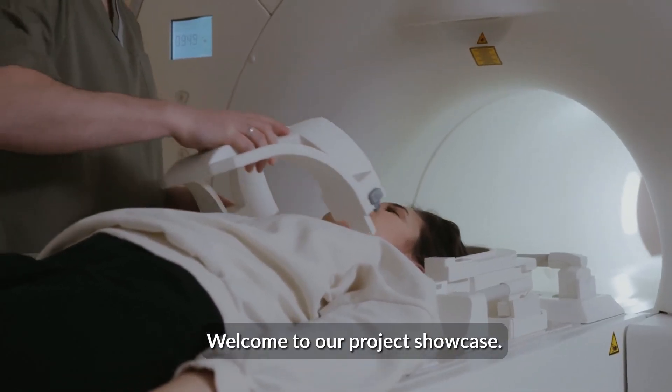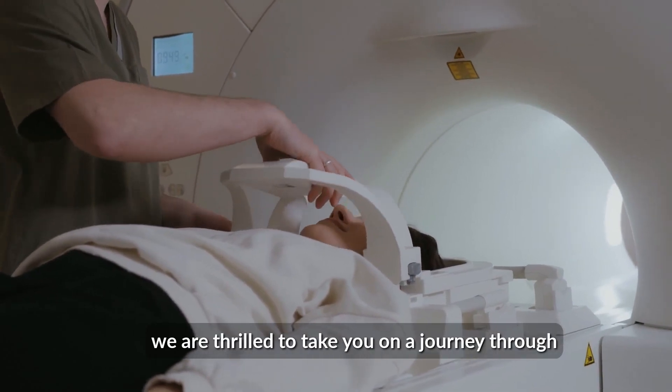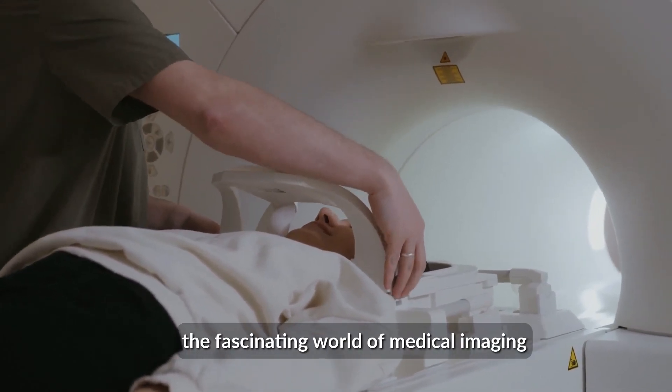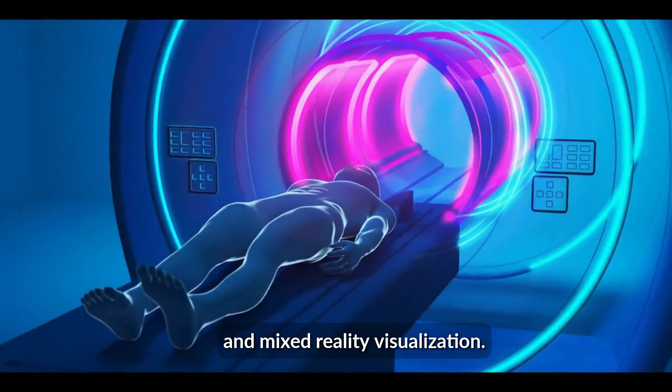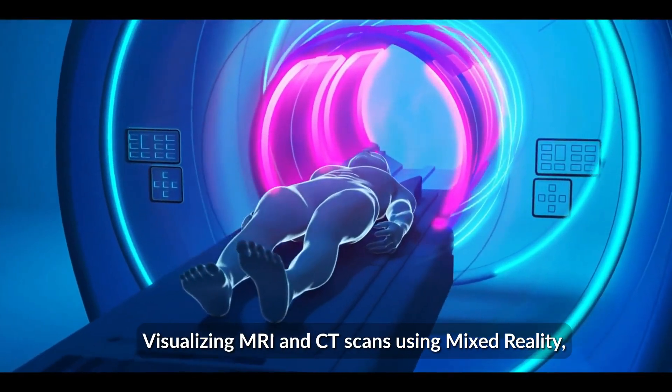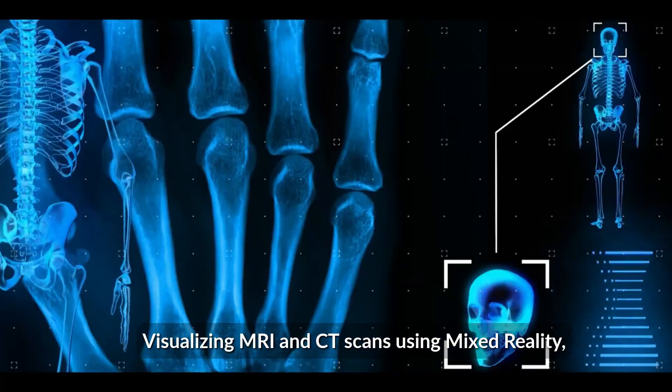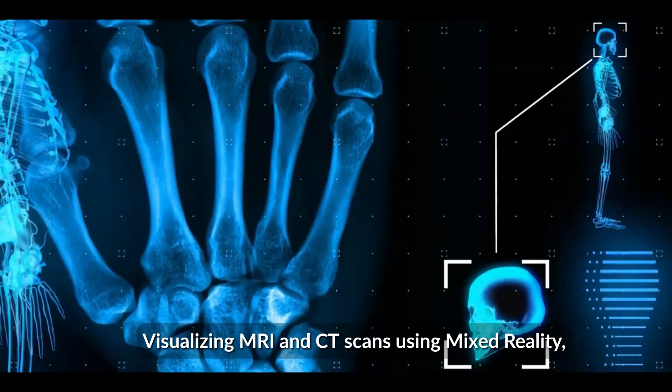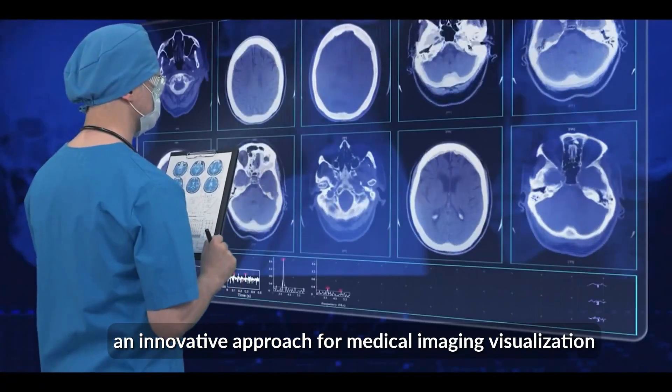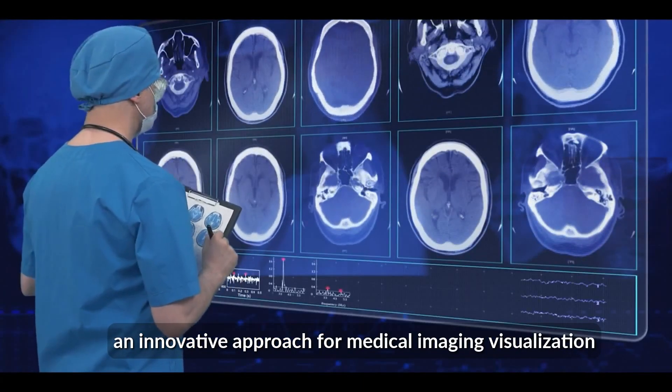Welcome to our Project Showcase. Today, we are thrilled to take you on a journey through the fascinating world of medical imaging and mixed reality visualization. Visualizing MRI and CT scans using mixed reality - an innovative approach for medical imaging visualization.